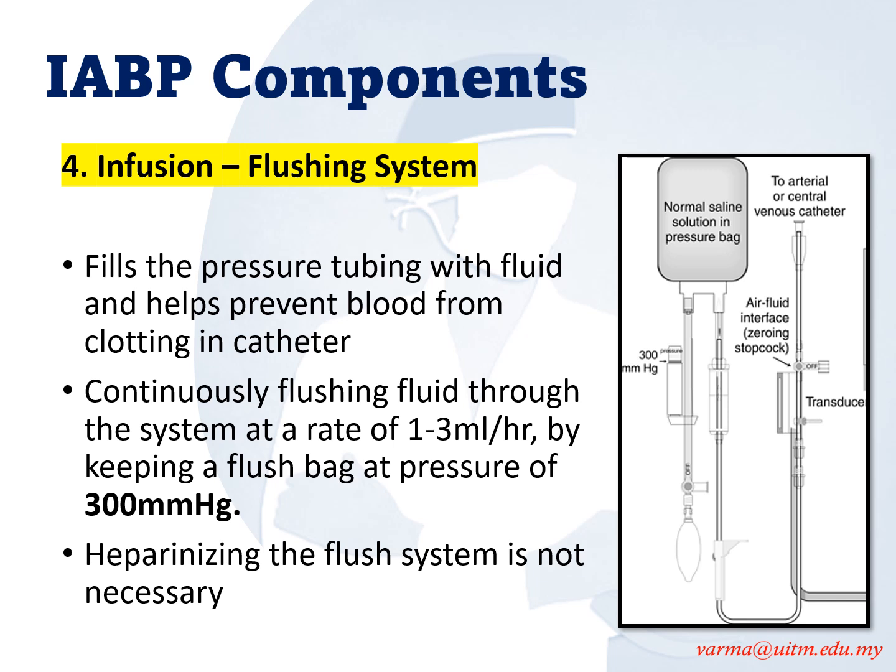If you look at it, this is the normal saline solution in a pressure bag which is being pressurized to 300 millimeter mercury, and the other end is connected to the flushing system at the transducer.